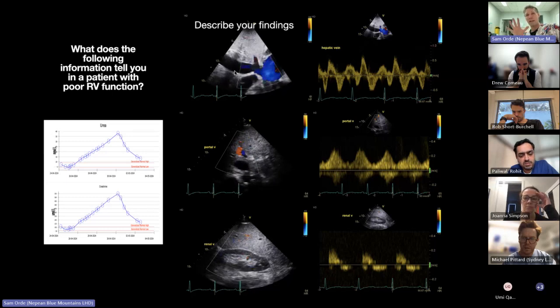It's not very good by itself to try and assess the bog standard patient for fluid status as a one-off. It might be useful as a serial kind of assessment, but we don't have a lot of great evidence for that. So congestion in things like heart failure patients, they've looked at it in renal failure patients, and it might be suggestive of being okay for looking for congestion in those.